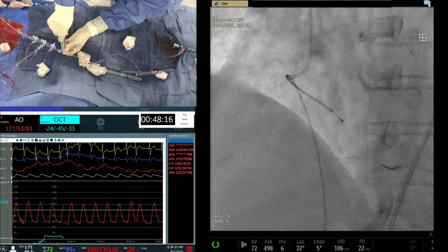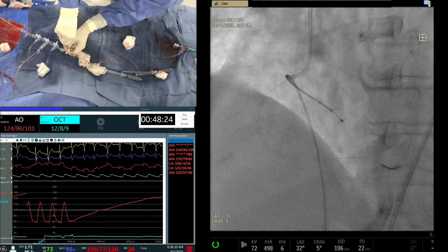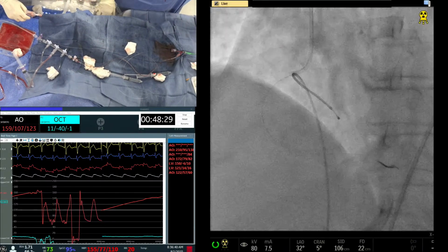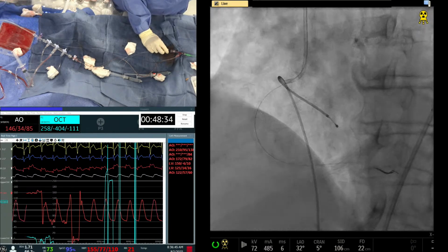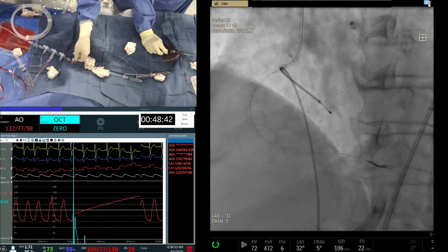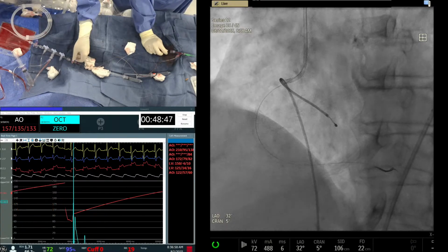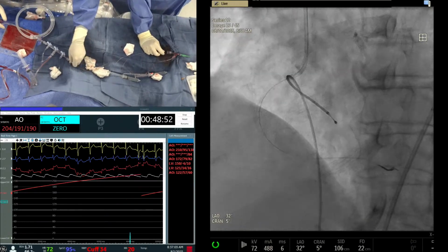Amit is actually giving me nitro. It's a tank of nitro that has been prepared. Okay, it's a big tank. Yeah, good. Okay, ready? Let us see. Ready? Good. Go. One second. Sorry, one thing about the assist, you know. Press it one time. Okay, sorry. You're used to the manifold settings. Okay, good. Okay, ready?